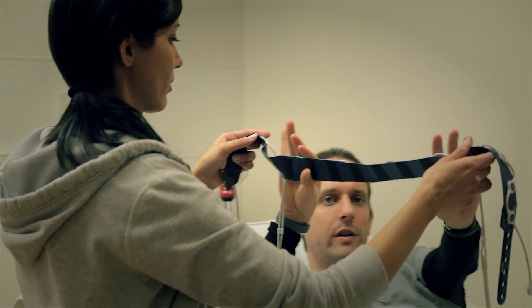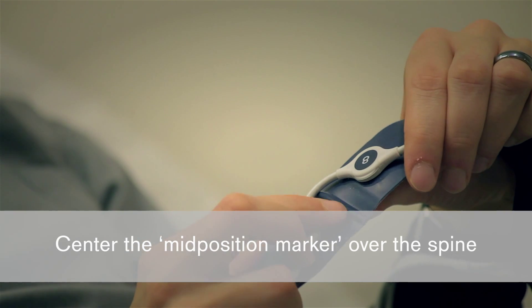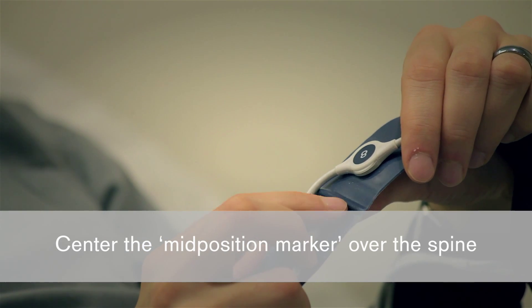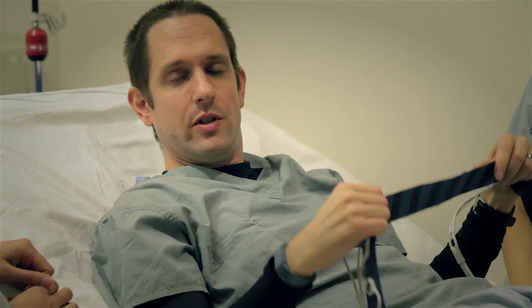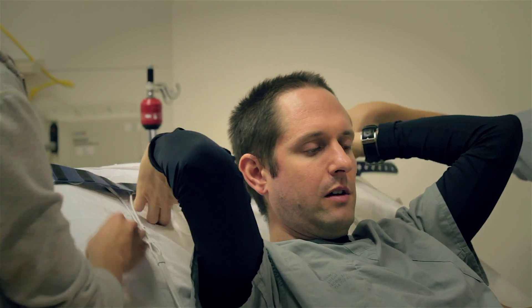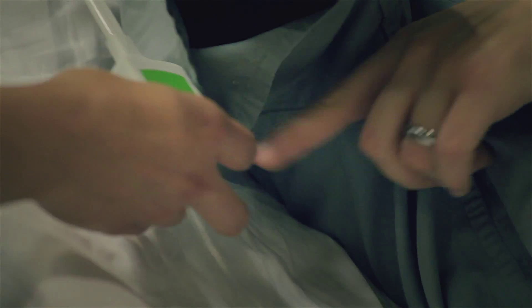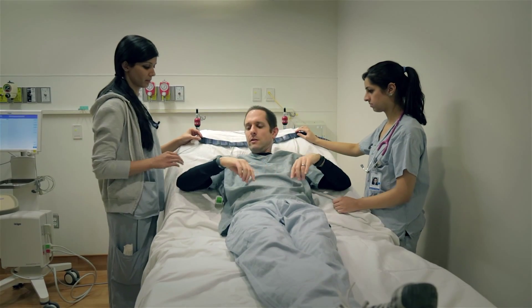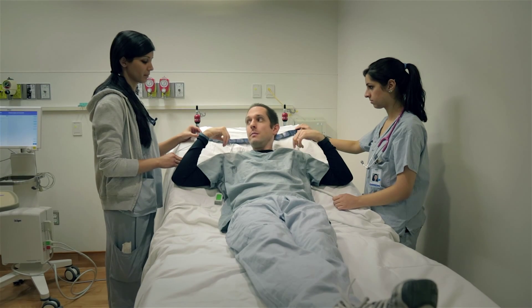One thing to point out on the belt: right in the middle, you'll notice a raised area — that's where it needs to sit, right on the spine. This has to be centered on the back of the spine. For positioning, put it up near the head of the bed, usually above the patient's head. Because of all the lines, tuck these pieces under the arms to get them away from the lines, so when you bring it down it's already below and doesn't get stuck up top.